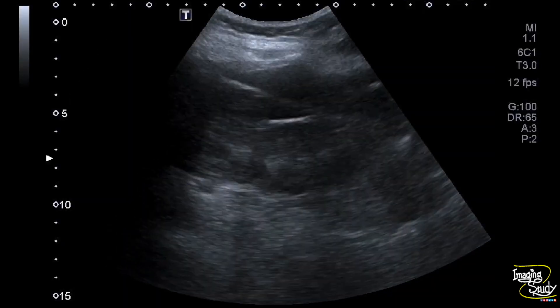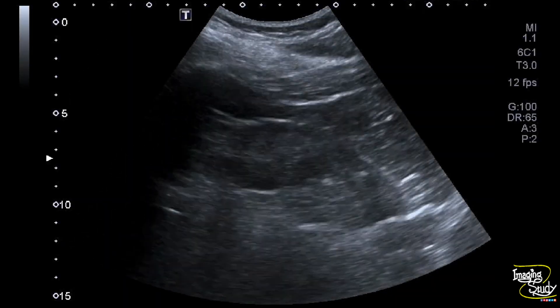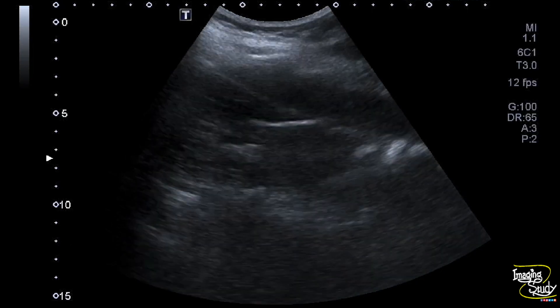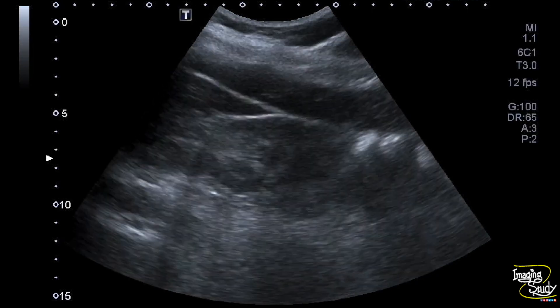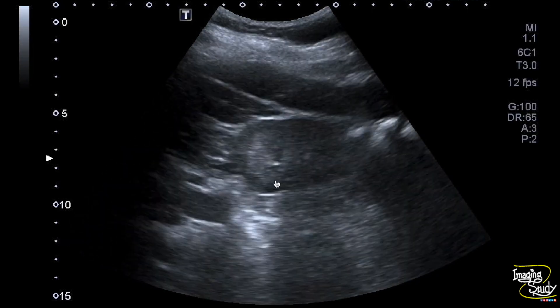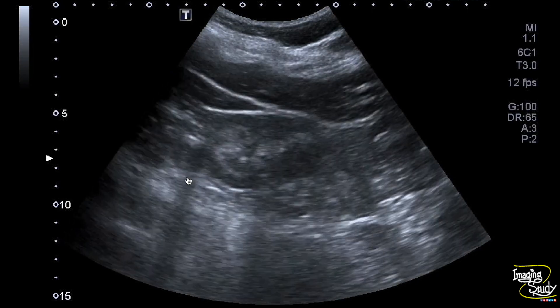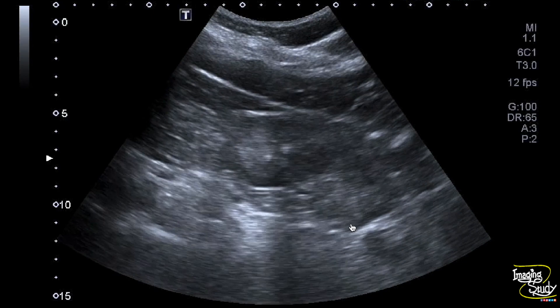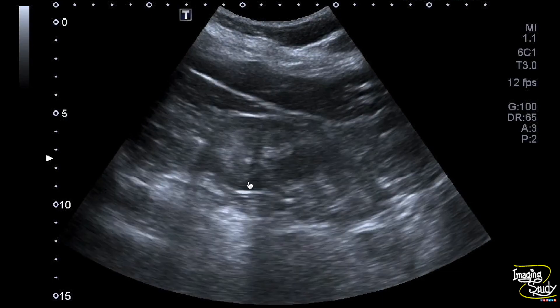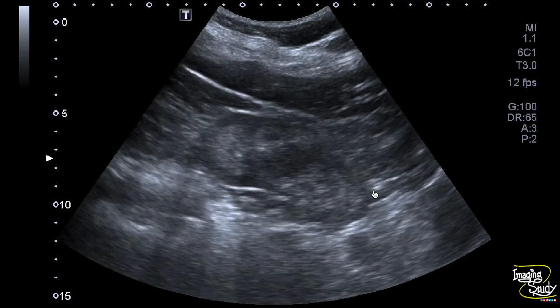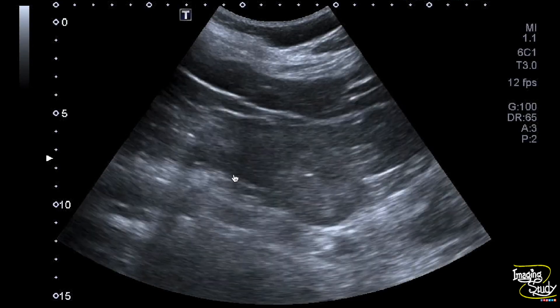We have checked the left kidney from the back of the patient. You can see increased medullary echogenicity is also seen here. These increased echogenic areas are also casting faint acoustic shadows.